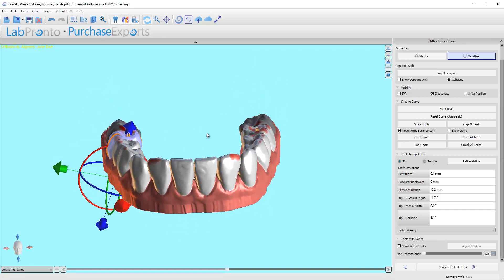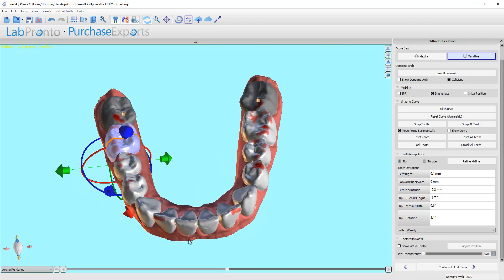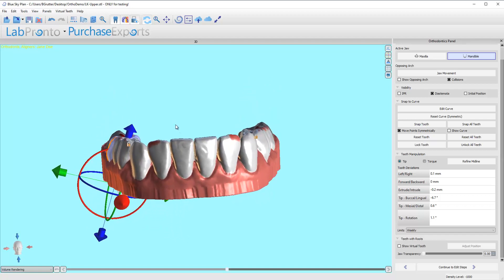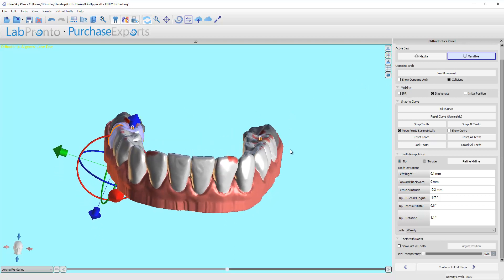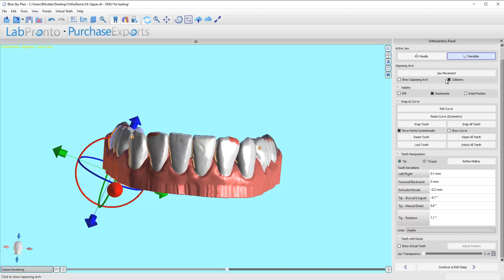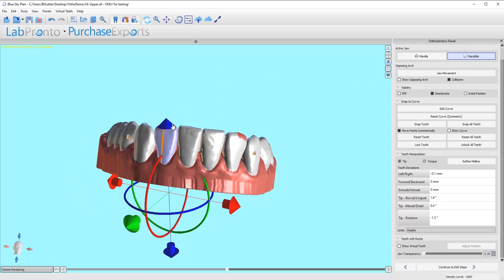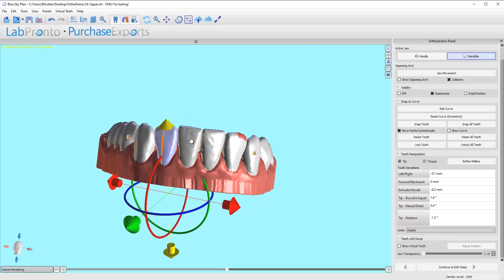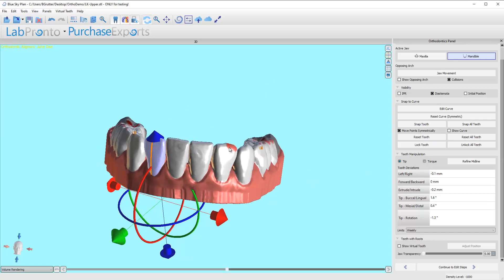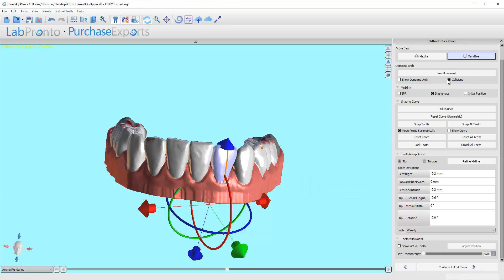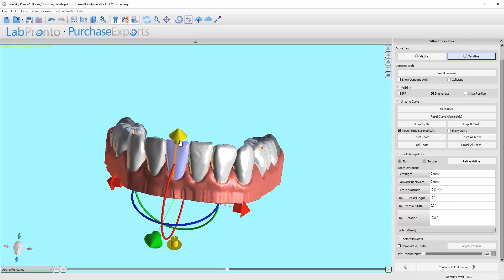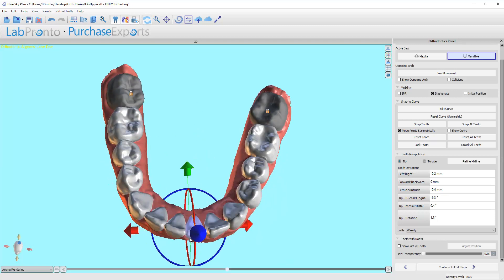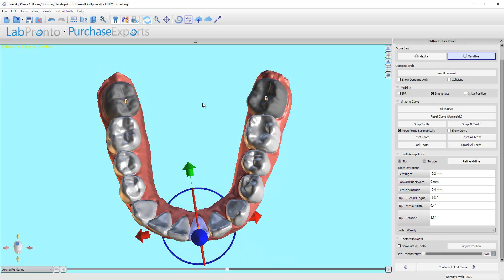That's more specific treatment planning of a case, and I'm really wanting this video to focus more on how to use the software, so I'm not going to spend much time on that in this video. But you get the idea—you may want to push these laterals down a little bit more or push the upper ones out. I'll go ahead and push them all down just a tiny bit. Occlusal contacts look pretty good there. Now I'm going to turn off collisions because every time you move a tooth with the collisions on, it ends up having to recalculate. So I can move a little faster if I turn that off.